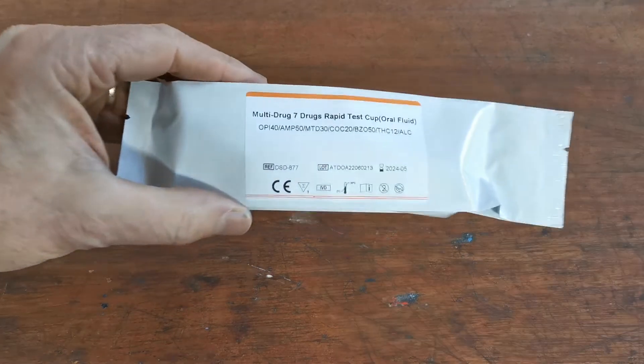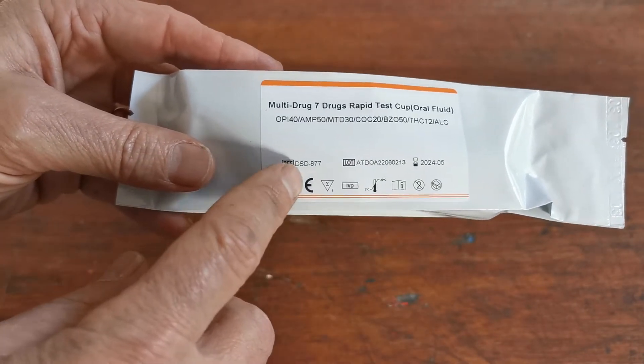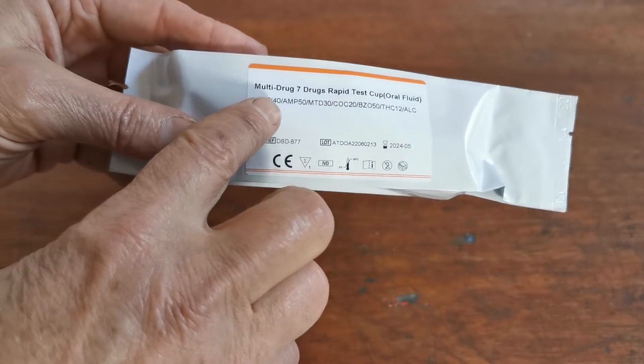This is the foil packaging — it's the standard all-test branding that you'll be familiar with. All the CE certification marks are along there with the lot and batch numbers and expiry dates relevant to when we're filming this test.